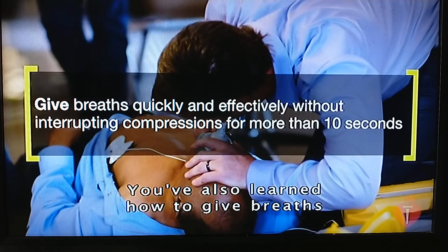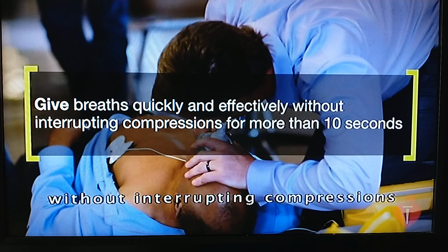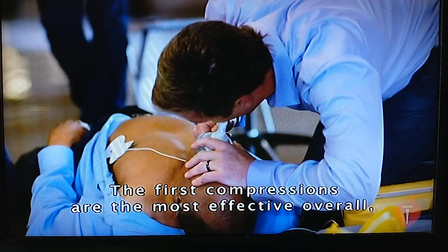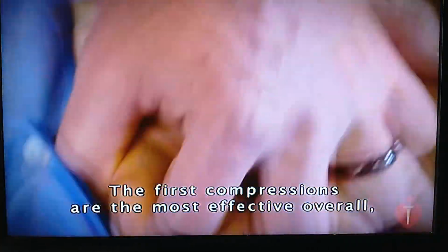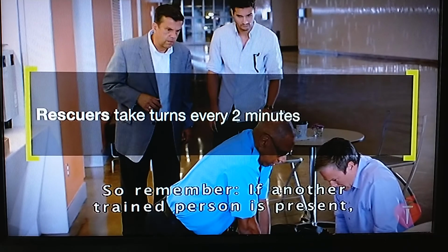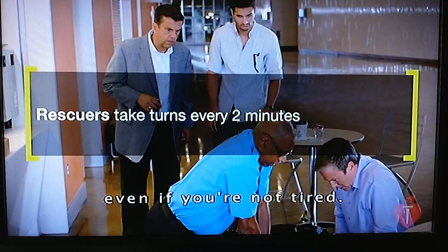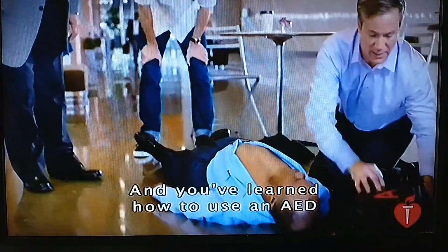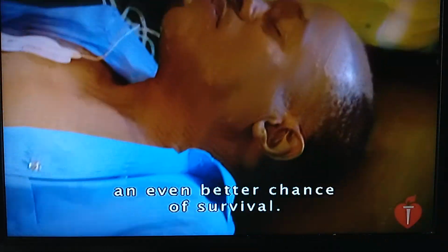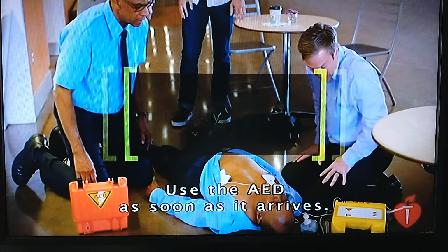You've also learned how to give breaths with and without a mask, quickly and effectively without interrupting compressions for more than 10 seconds. The first compressions are the most effective overall, and they become less effective as you get tired. So remember, if another trained person is present, take turns at least every 2 minutes, even if you're not tired. And you've learned how to use an AED to give a person in cardiac arrest an even better chance of survival. Use the AED as soon as it arrives.